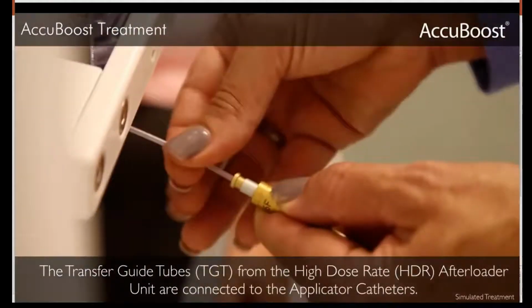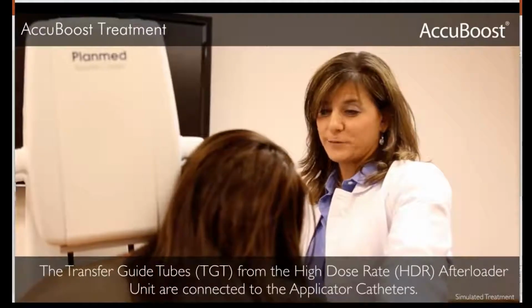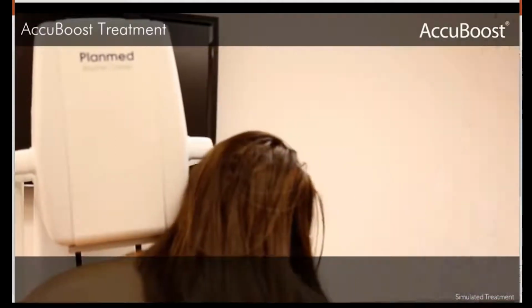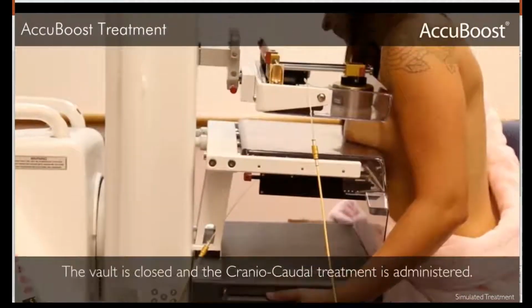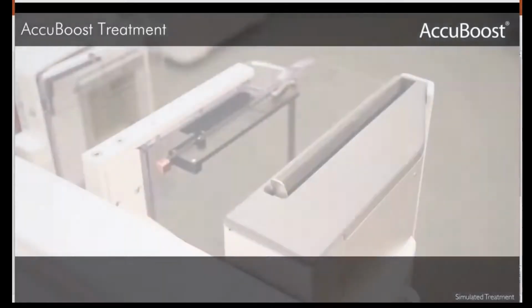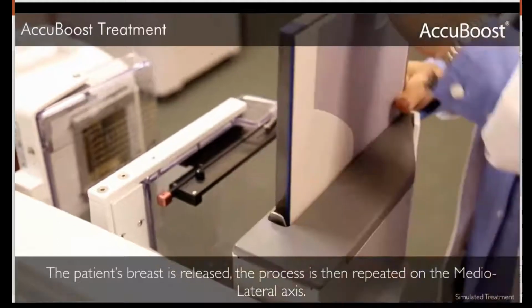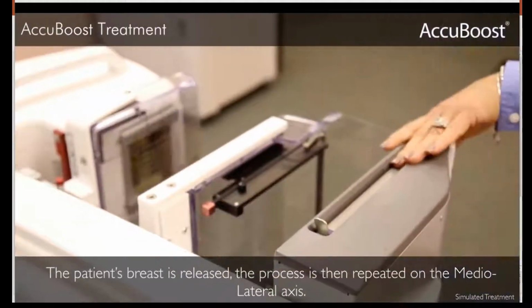The applicator tubes are now connected to the HDR unit. The test cables are run, and then this process is repeated in the orthogonal axis.